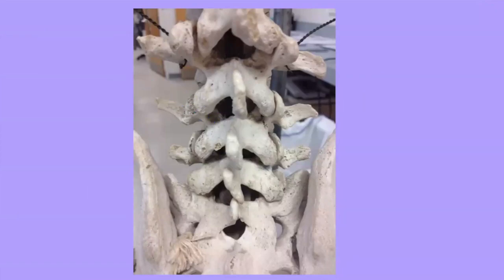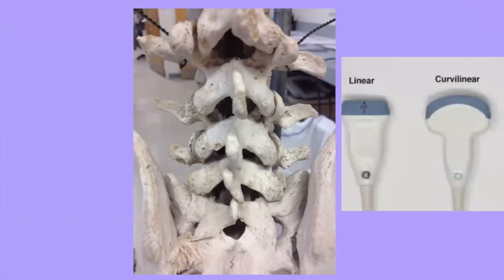What probe would you use for this procedure? I'm hearing curvilinear. Okay, yeah. And would anyone use the linear probe? Yeah, why? Resolution, yeah, oh, y'all are so smart. Yeah, so you really can use any probe.